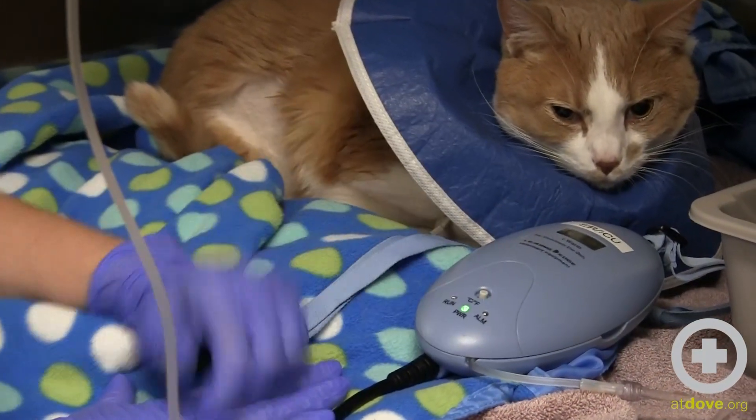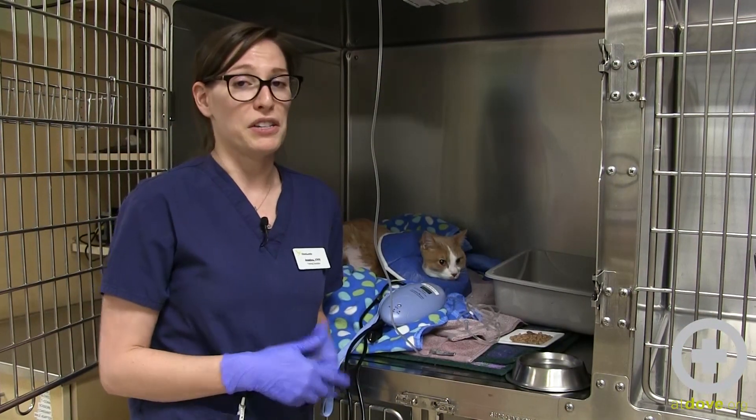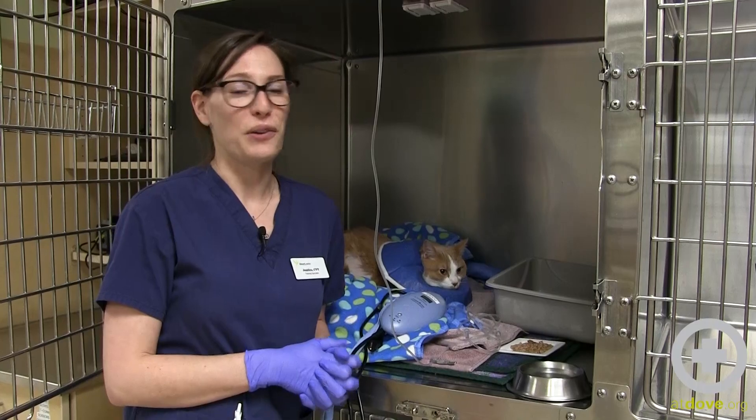This is most helpful in patients that are not very mobile — maybe they're anesthetized or laterally recumbent — because if you have a happy, moving around lab with the IV fluid warmer, it's either not going to stay on there very long or not be so helpful.